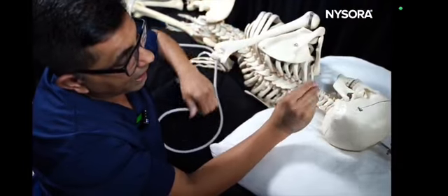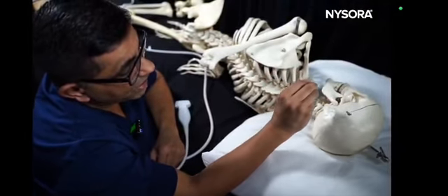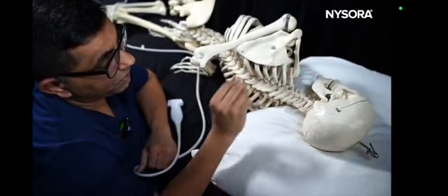But if you are doing an out-of-plane technique and you're heading from posterior to anterior, and if you miss the bony target, you will end up either getting into the vertebral artery or the nerve root.